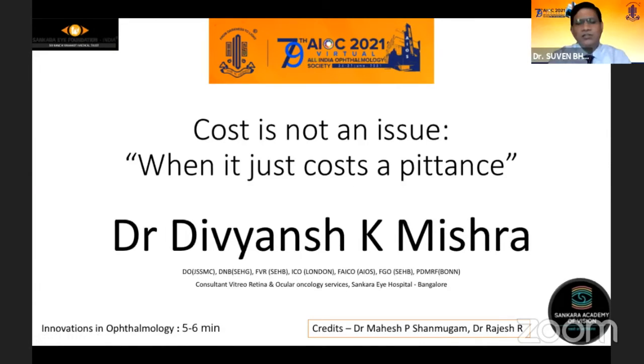How much does it cost? Sir, this anti-fogging solution costs around 200 to 300, but now there are cheaper solutions available around 100 rupees. Also, we can get them from the markets. And you've tried and tested that it does not damage the microscope? Yes, sir. We have been using it with comfort. There are no complaints until now. Nice job. Thank you.